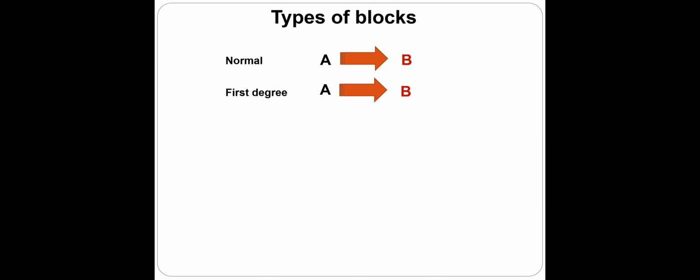What do you think? Is this rhythmic or arrhythmic? It's rhythmic. Exactly, that's rhythmic because the conduction speed is not changing. It's constant, but slower.